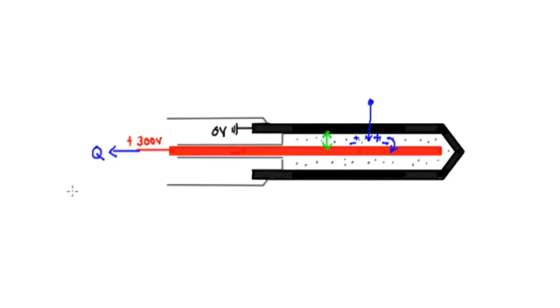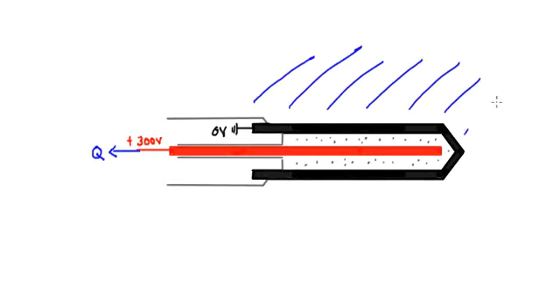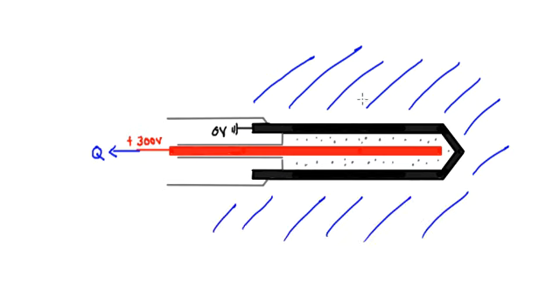That's the charge Q. Now, of course, as I talked about before, this thing usually sits in some medium. So modern chambers here would be waterproof. You stick them in water, and the charge is created in water and comes in here. Sometimes it can also be created in the wall, and there's a kind of a correction factor for that we'll go through in the problems.